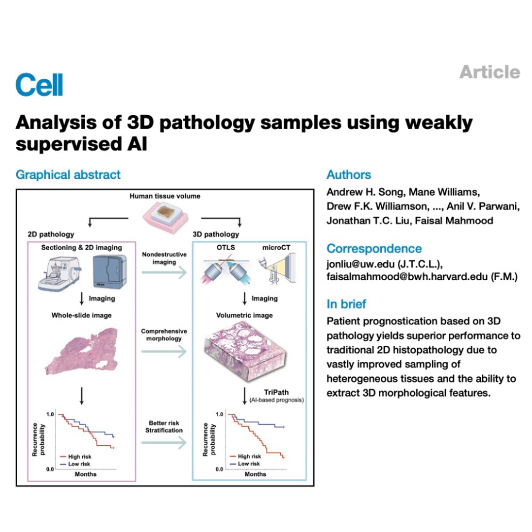But they took it a step further, didn't they? Something about giving the pathologist more data. Yes, this was fascinating. They thought, okay, maybe pathologists are limited by only seeing a few slices. What if we show them everything? So they gave the pathologist access to the entire stack of 2D images from the OTLS scan. We're talking over 300 image levels per biopsy. That's like 100 times more visual data than they'd normally see from a biopsy. Okay, now it's a fair fight, giving them all the 2D info.